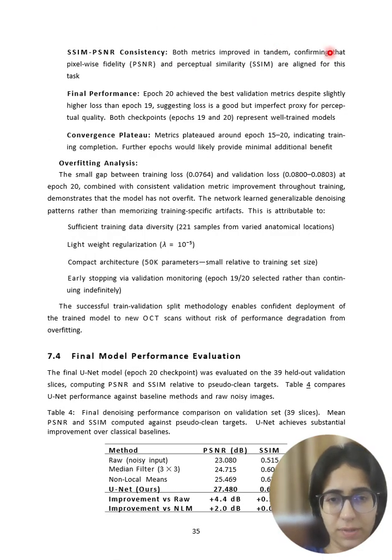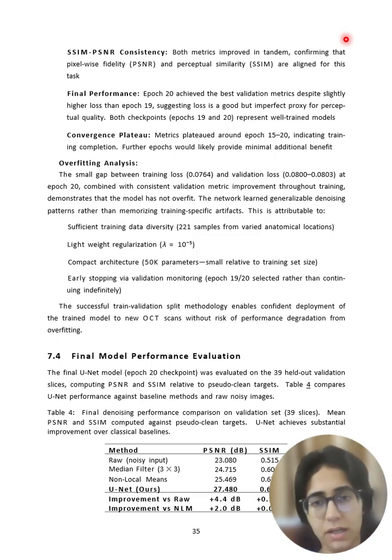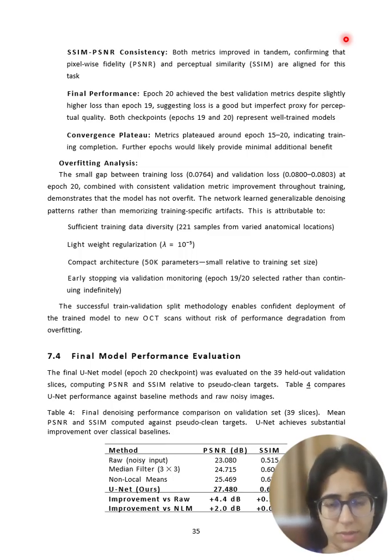So the consistent improvement in SSIM and PSNR shows that there is improvement in the learning part, and the final performance is taken at the 20th epoch. The overfitting analysis: overfitting means that when our model, instead of learning the patterns of how to predict the output, it actually learns the output with reference to the input. We do not want overfitting. That is what we have discussed in this part.